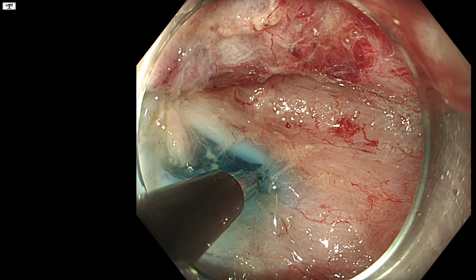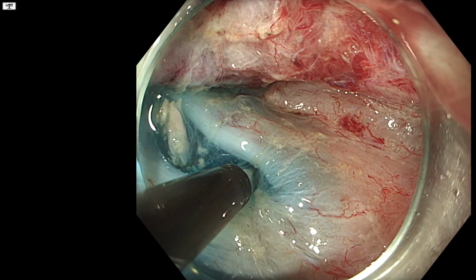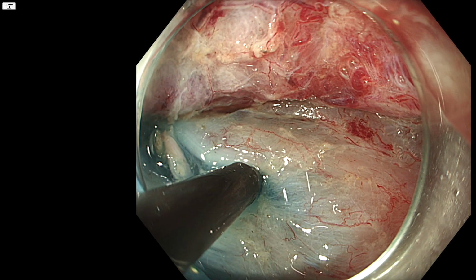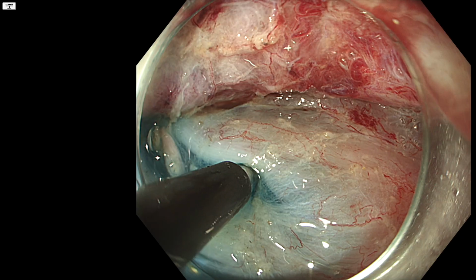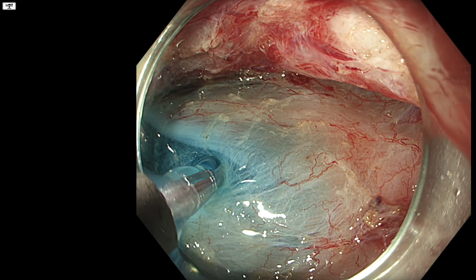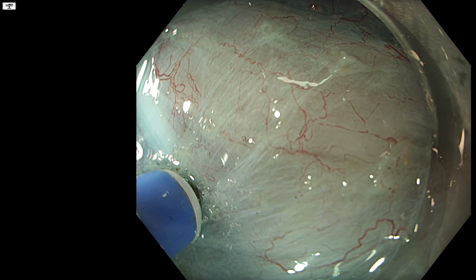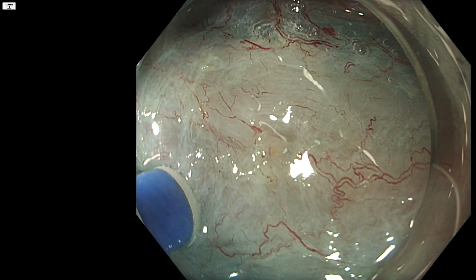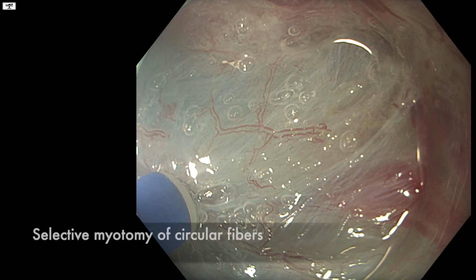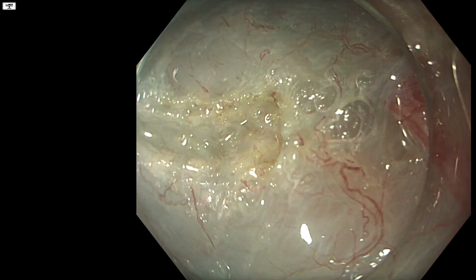If you're positioned far enough back, the tissue between the muscle fibers actually lifts quite nicely with injection. Here we're using the same solution as we used for submucosal injection, which is a mixture of gelifusin, epinephrine, and a small amount of indigo carmine. Some people don't use the indigo, but I think it's quite useful to contrast the muscle with a small amount of connective tissue in between. And as you can see, we're now performing a selective myotomy of the circular muscle to open up the intermuscular plane.